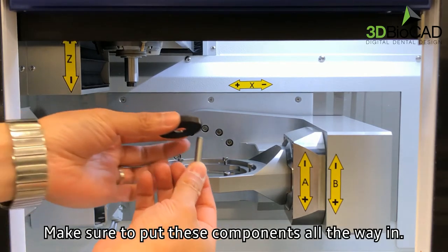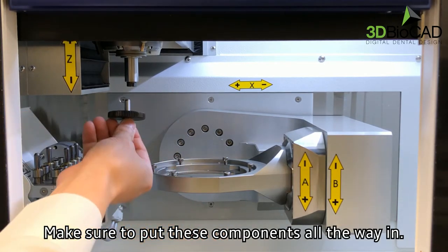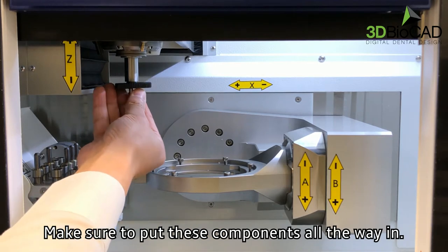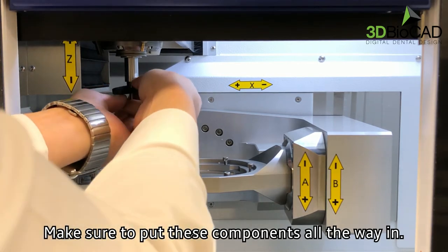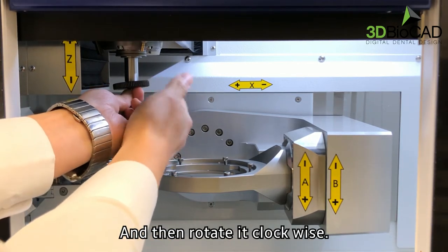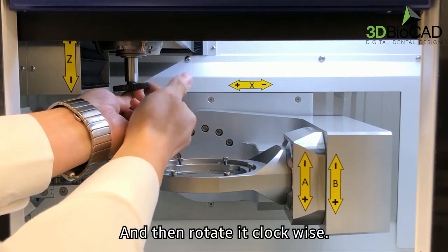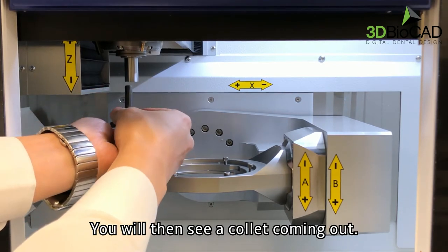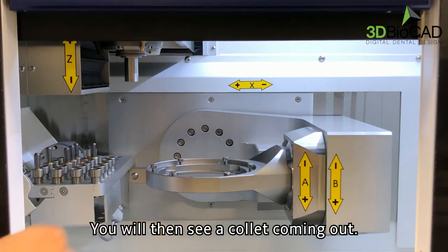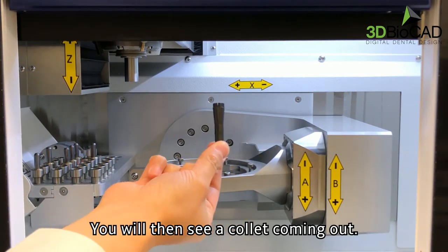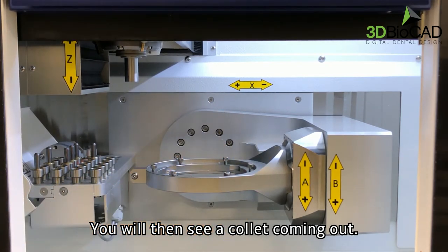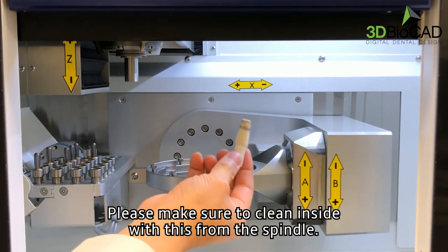Make sure to put these components all the way in, and then rotate it clockwise. You will then see a collet coming out.